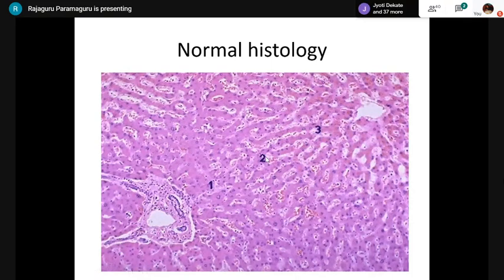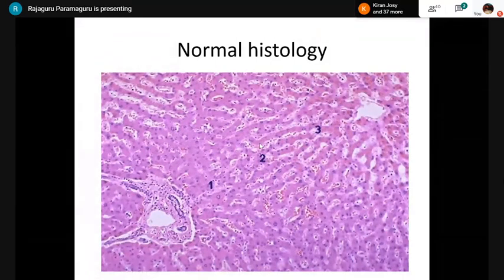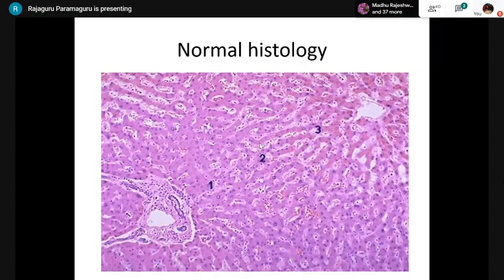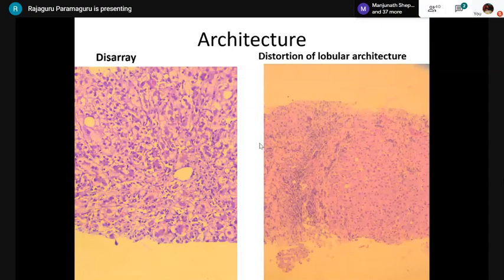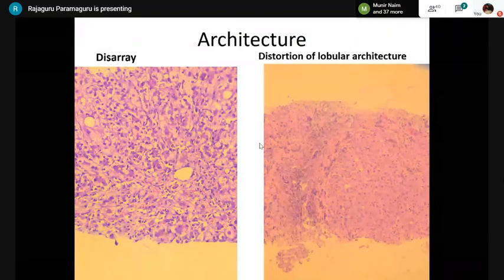These are specialized endothelial cells — when you do CD31 and CD34, they may show faint staining in normal liver parenchyma, whereas in hepatocellular carcinoma, strong CD31 and CD34 staining will be demonstrated. But we are not discussing neoplastic pathology here.